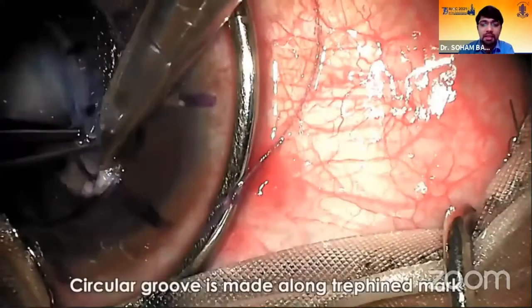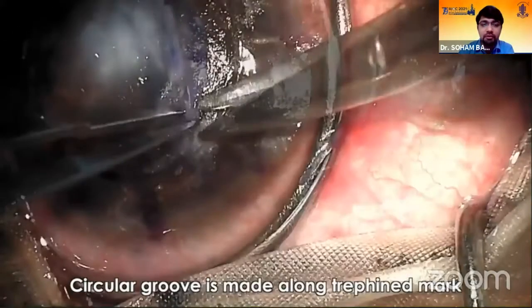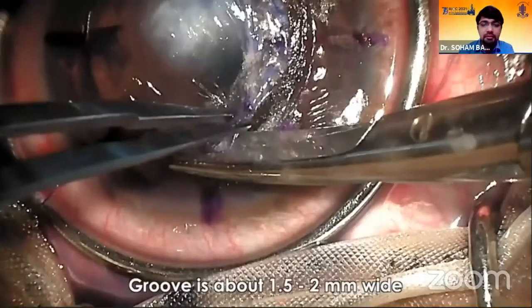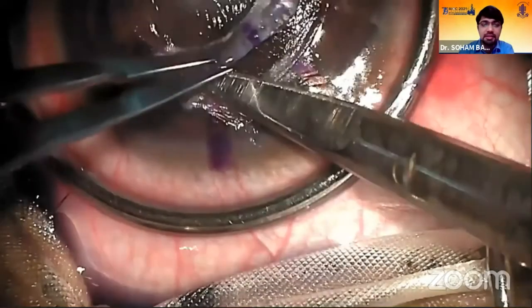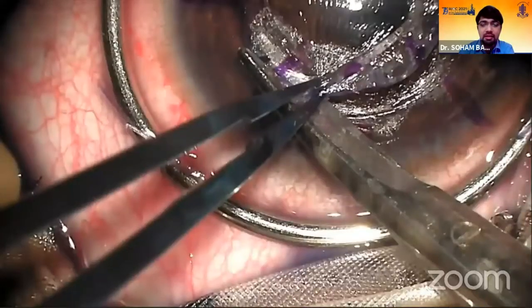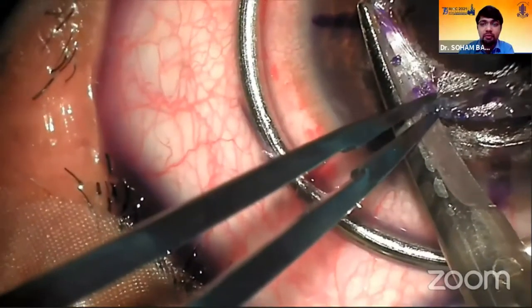So go around making a 1.5 to 2 millimeter wide groove. And the depth is judged by the eye. And this is just a blunt dissection technique. The scissors I'm using, this is a peritomy scissors, which I'm very comfortable with somehow. So you can use any corneal scissors, anything which has got a blunt tip, that is most important.